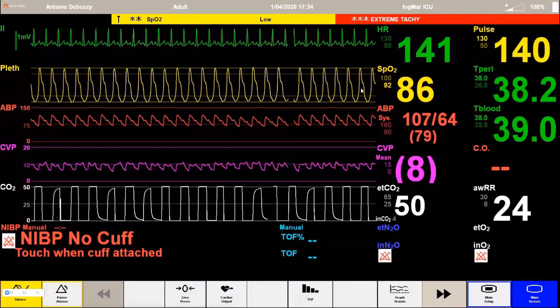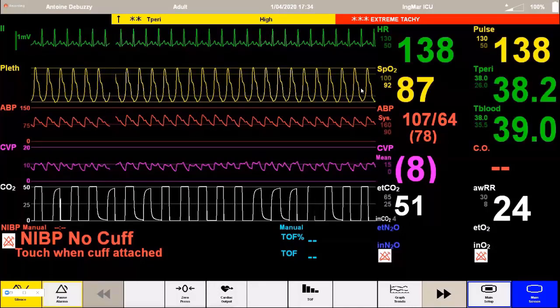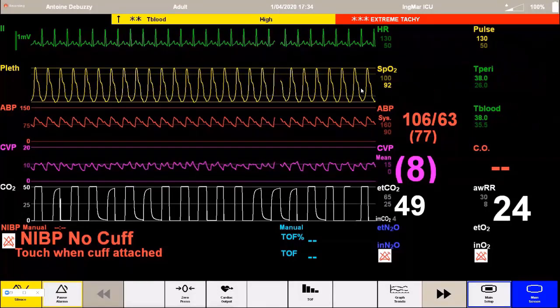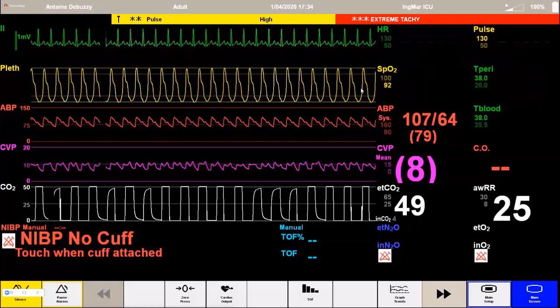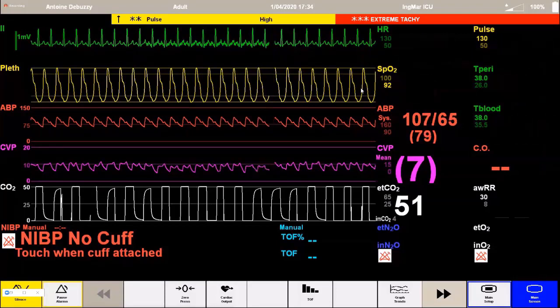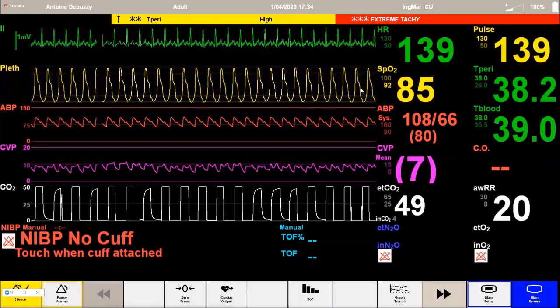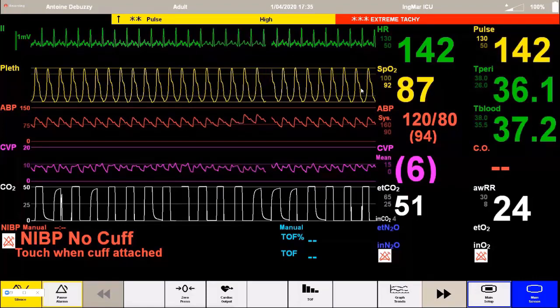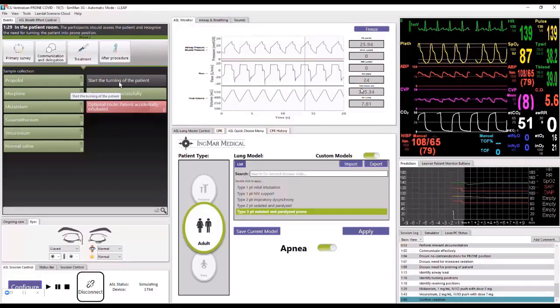So here on the patient monitor screen, you see prior to us moving the patient into the prone position, a normal ECG trace. Obviously the oxygen saturations are low and CO2 is high. But as we go into the prone position movement, you will see artefact on the ECG. As proning can cause some hemodynamic instability, we have built a little bit of a trend at this point so that you can see some changes to the hemodynamics so that people are reassessing and reevaluating their patient.